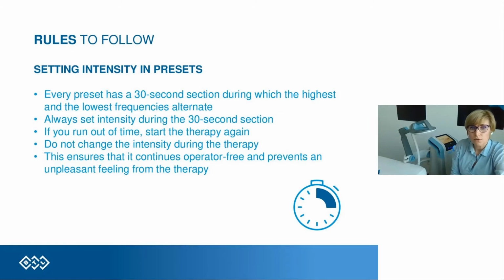So regarding the frequencies, we have modalities of the frequencies, and we are focusing on pain management. But also, what is very important here is to apply adjusted intensity to the patient and to the goal we want to reach.